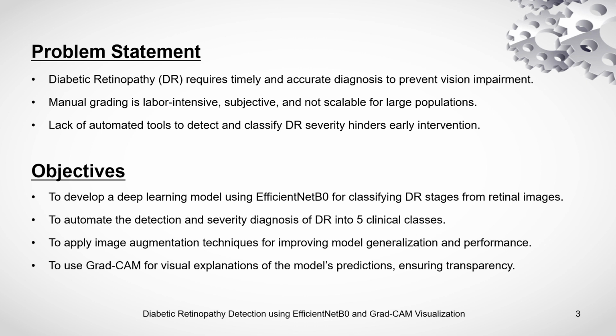The objectives are: first, to develop a DL model using EfficientNetB0 for classification of the DR stage from the retinal image; second, to automate the detection and severity diagnosis of DR into 5 clinical classes; thirdly, to apply image augmentation techniques for improving model generalization and performance; finally, to use Grad-CAM for visual explanation of the model's prediction, ensuring transparency.